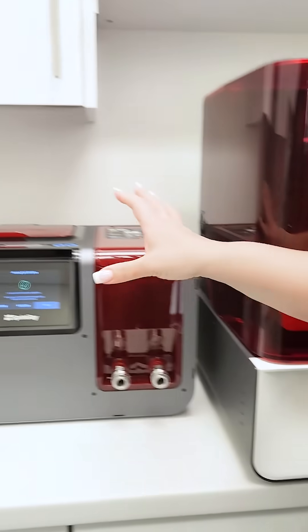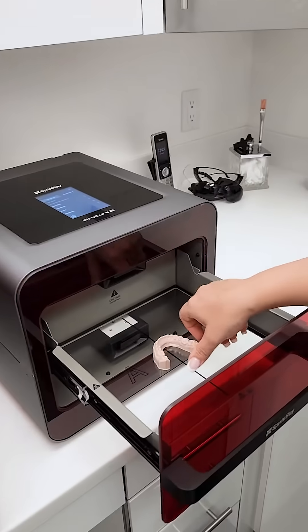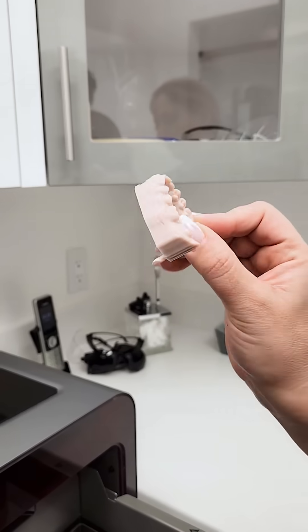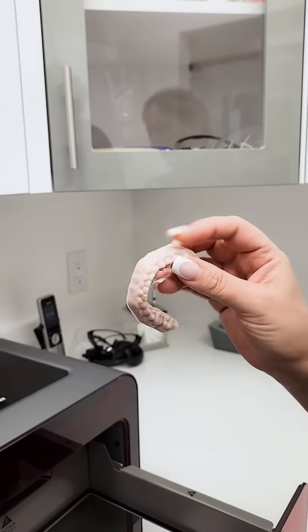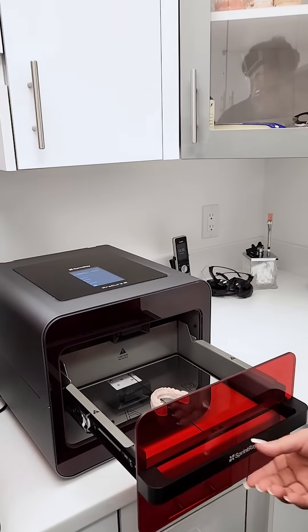There's equipment that cleans it, and then it goes to the light here. This is actually something we just printed — instead of pouring the old cast, this is how we print the models. We can keep them, we can label them, and from this we can make so many other products: night guards, retainers, temporary crowns.